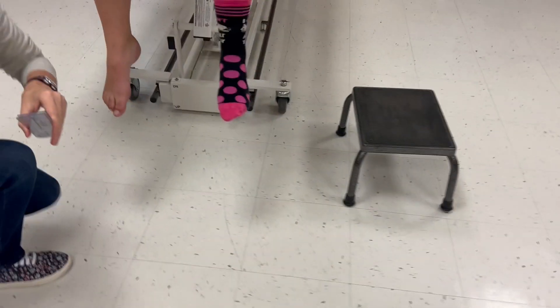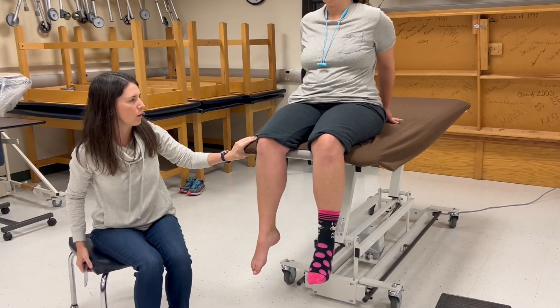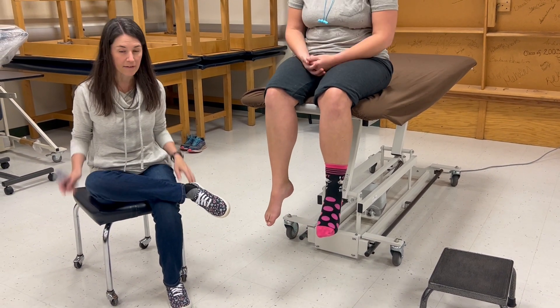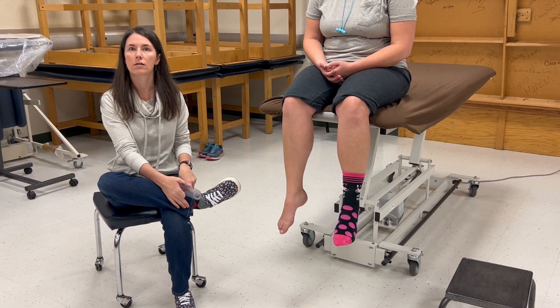Now we're going to do manual muscle testing, starting with inversion. I'm going to have the patient side lying, though you could also have a patient sitting on a wooden chair — not a rolling stool. If they can get into the side-lying position and invert, that is also against gravity.